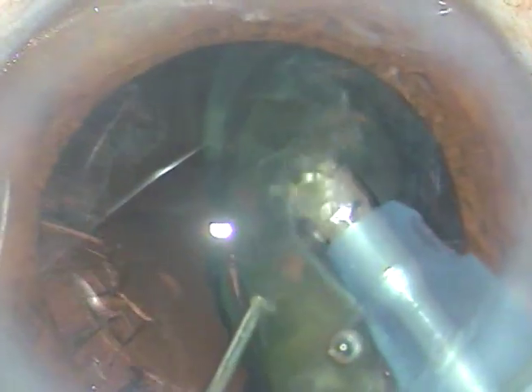Phaco power is very minimal in this case — about 30%. Flow rate is 40 and vacuum is 350. This is the last portion of the nucleus, and it is managed.